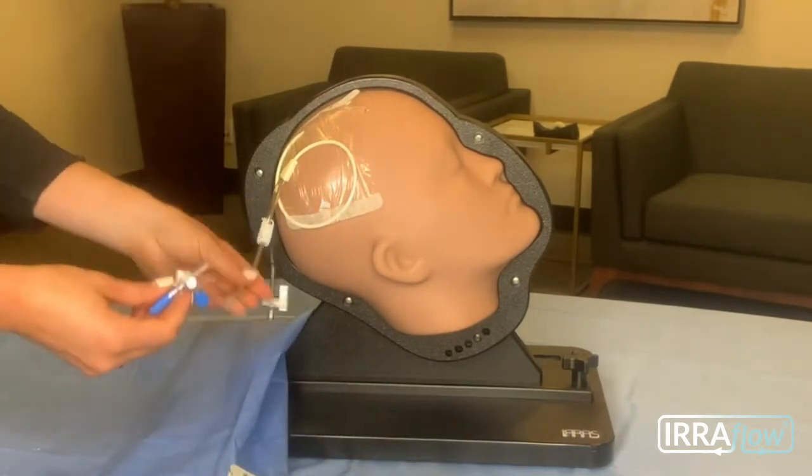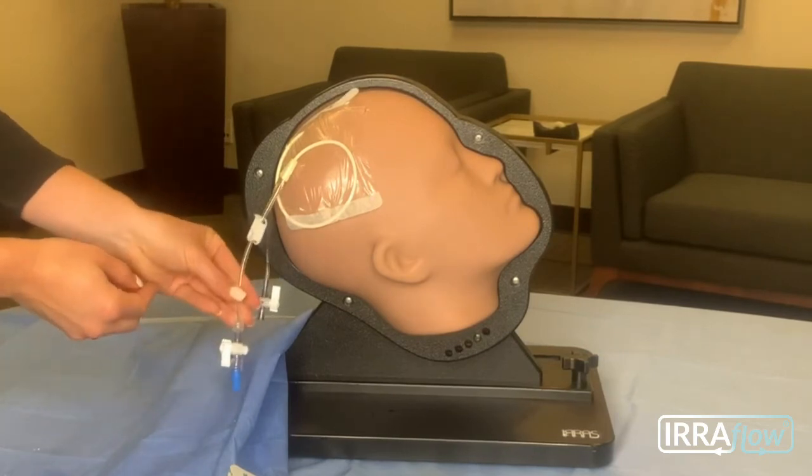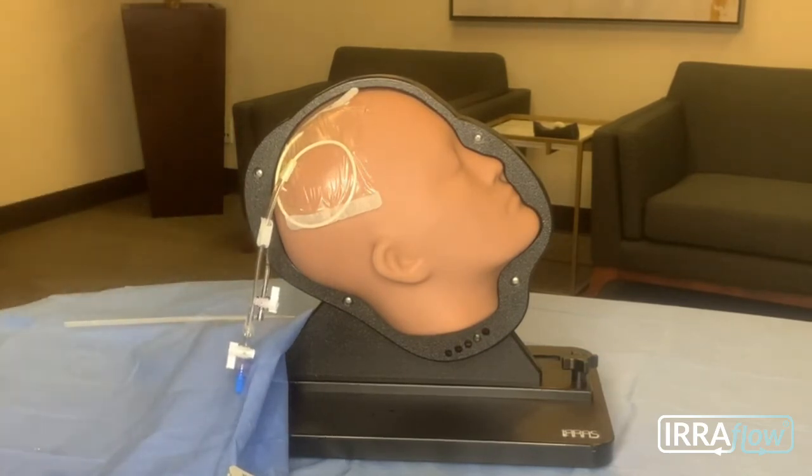Finally, add a 3-way stopcock to the catheter's drainage lumen. This will allow you to draw CSF samples, if required, or to maintain access during treatment.